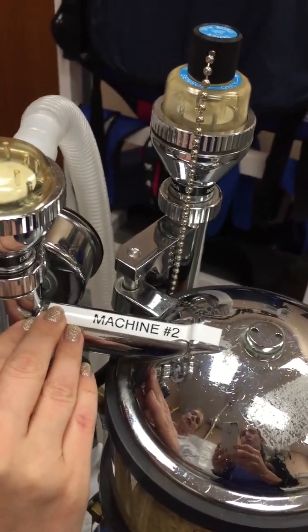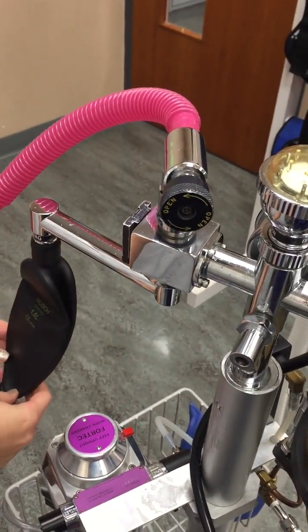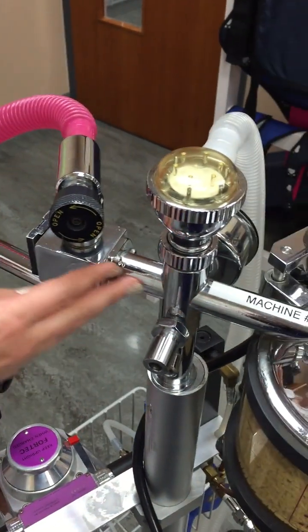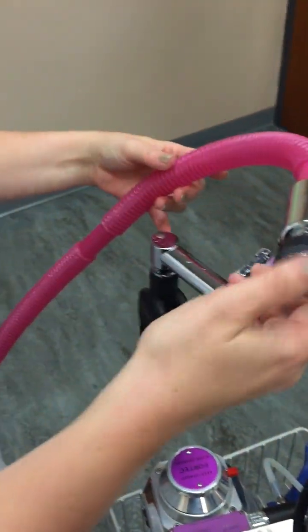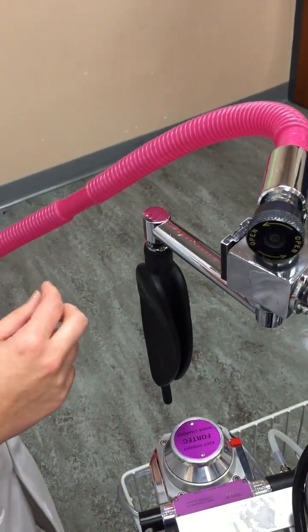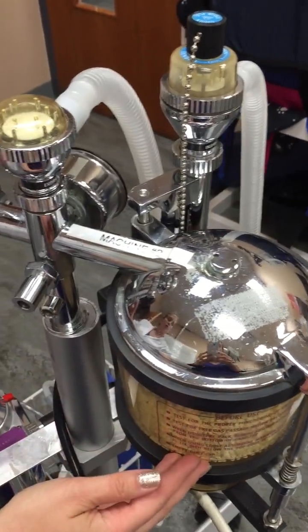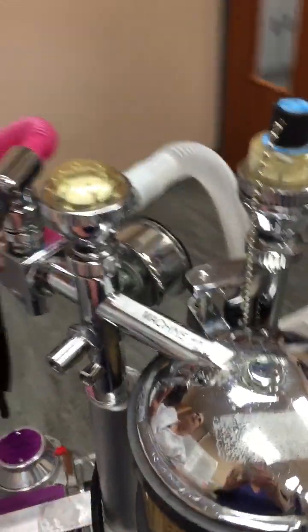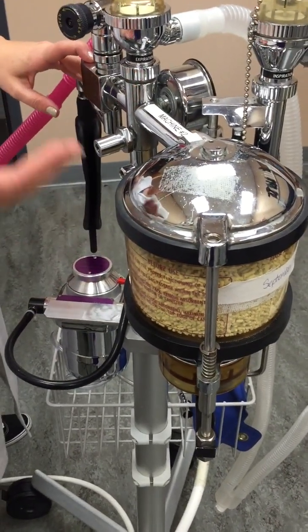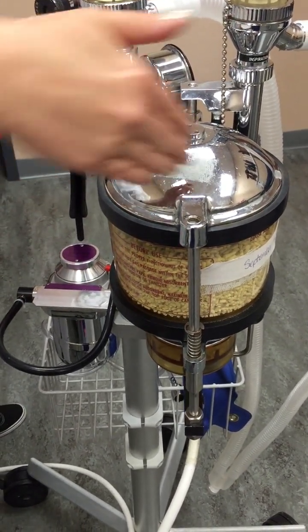Some of the gas will go through this tube here and to our reservoir bag, along with fresh gas and oxygen as well from our system. Some of the gas will come out here and go out our scavenge, so we'll always have our pop-off open, and the rest of the gas will come out the scavenge hose. And some of the gas will be going through here to the CO2 canister, where it will absorb any exhaled CO2 and leave any exhaled isoflurane or oxygen to be going back to the patient.